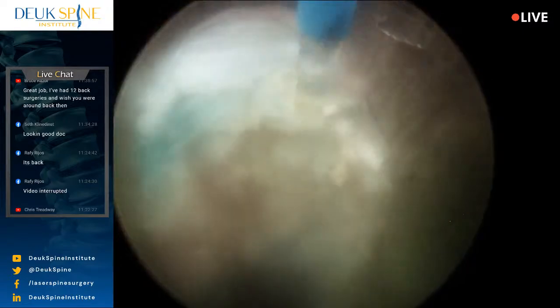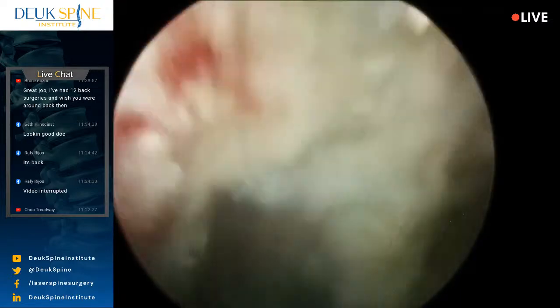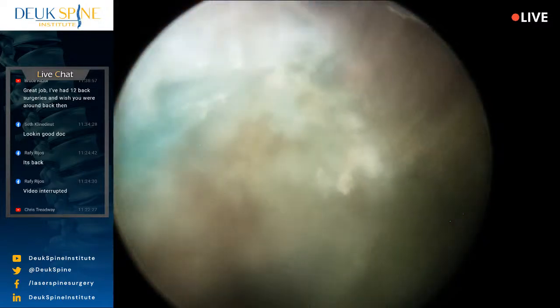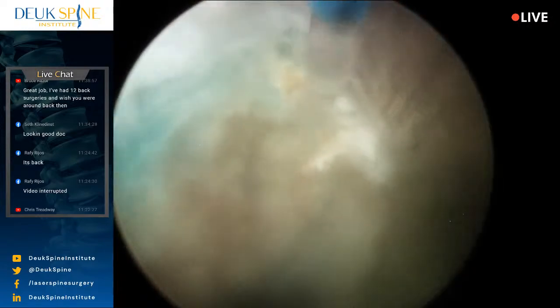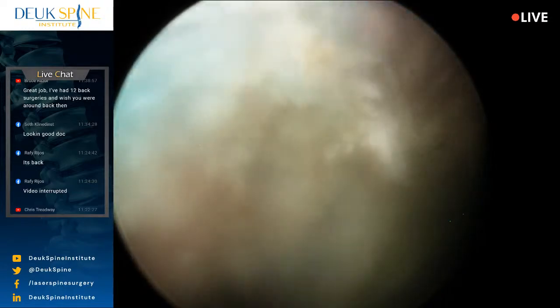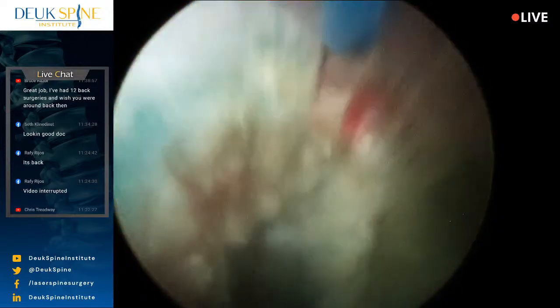So I got to remove as much of this as I can to unpinch her nerve. Now, by also debriding the annular tear, it allows her disc to heal properly so that she doesn't get another herniation. So she just has to be real careful while it's healing to allow the healing to be completed. It takes a year to fully heal one of these because the annulus doesn't get much blood supply.